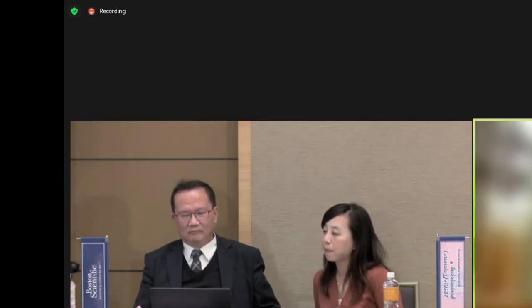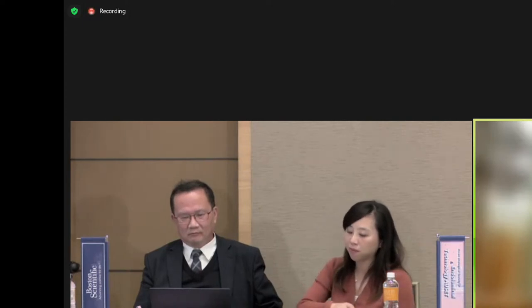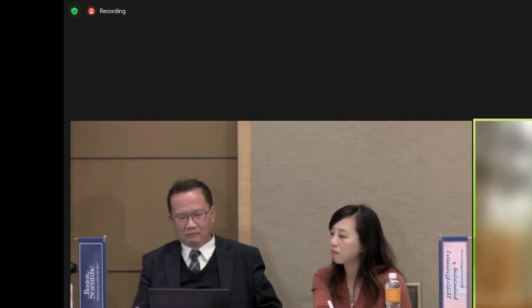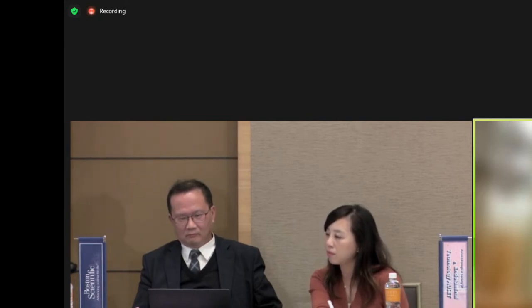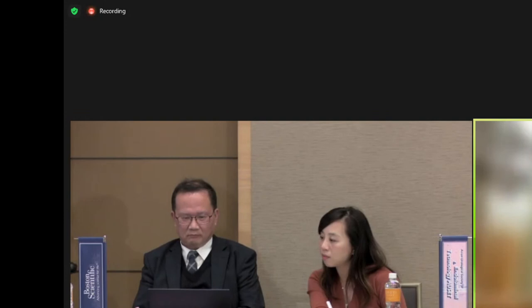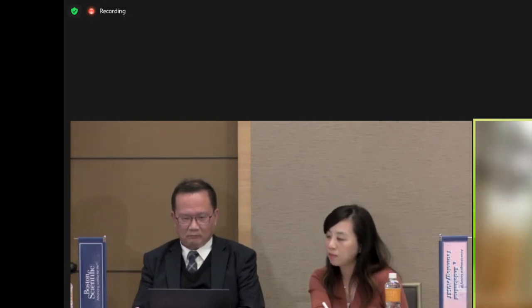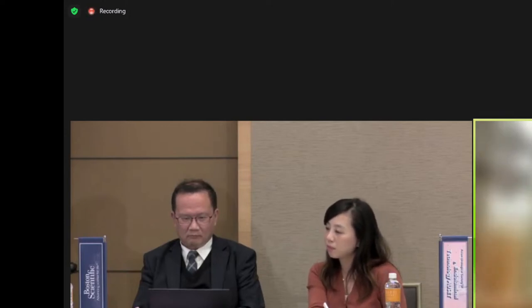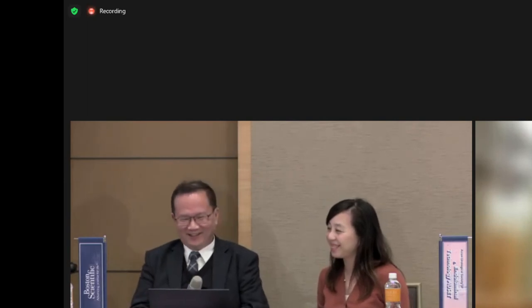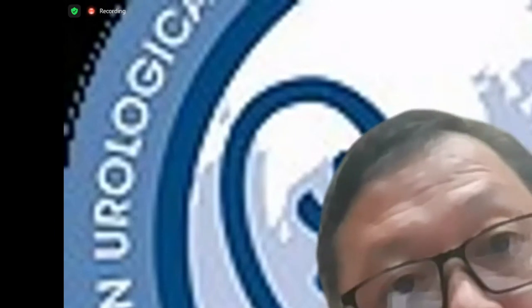Thank you for your good question. In my studies, I use thulium laser and en bloc resection, using the fiber following the video. After that, we suction the tumors out of the bladder. In this study, we chose tumors of about 2 centimeters so that we can do the en bloc resection.